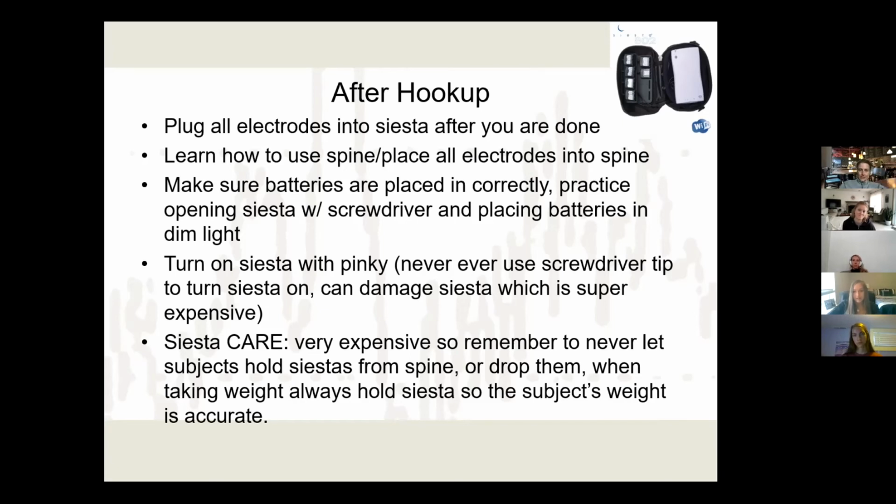Yeah, I want to reiterate that because the longer you have a piece of equipment in the lab, the more it can start to be taken advantage of. The fact that we have to use a screwdriver to take off the battery cover means we have to be so careful, because just like Shannon said, in Boulder the screw used to close that battery cover gets stripped if it's mishandled and overused, and then all of a sudden you have to start duct taping the siesta, which gets worse and worse, and gets all gummy and disgusting looking. Even if it's not dirty, it looks really dirty, and it's giving the wrong impression to our participants.